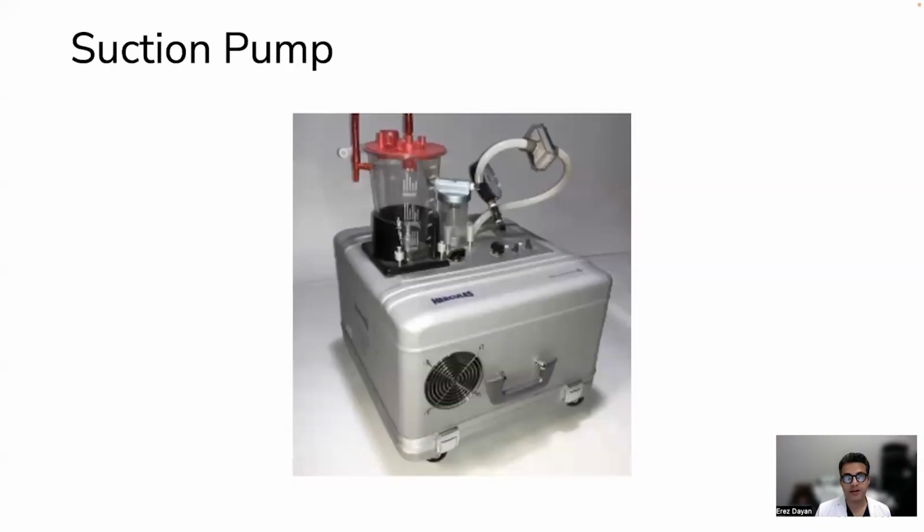There are many different pumps you can use. It's basically just a vacuum pump. My preferred device is called the Wells-Johnson Hercules. It has 3 motors on it, and here we have our setup. You'll have a canister, which is attached to your vacuum pump, and then there's another attachment here that's going to attach to our actual tubing for the liposuction.